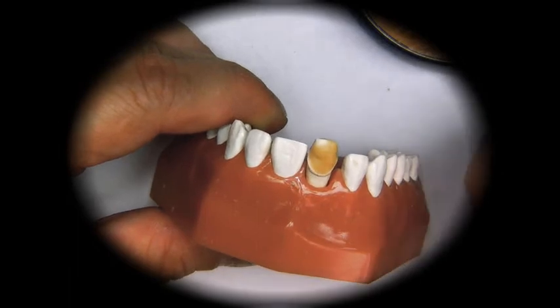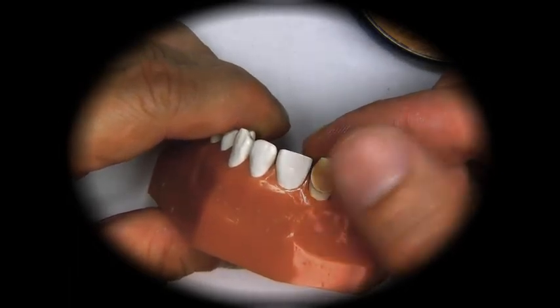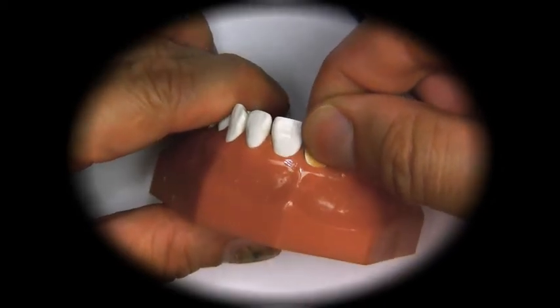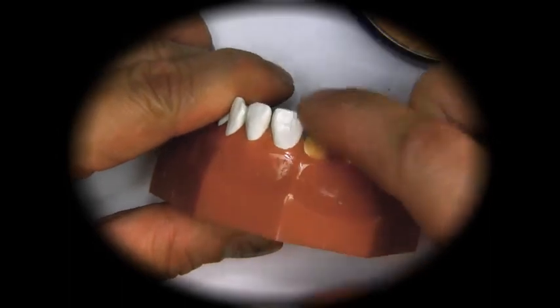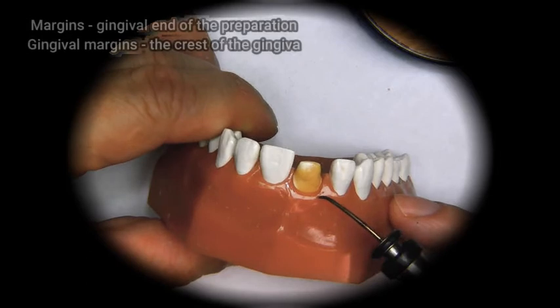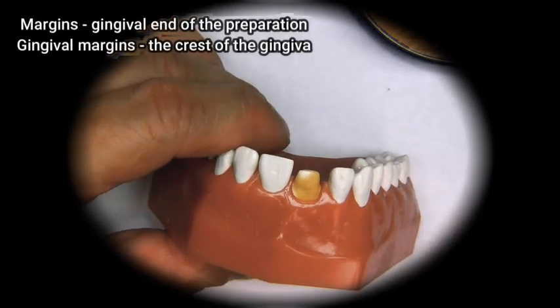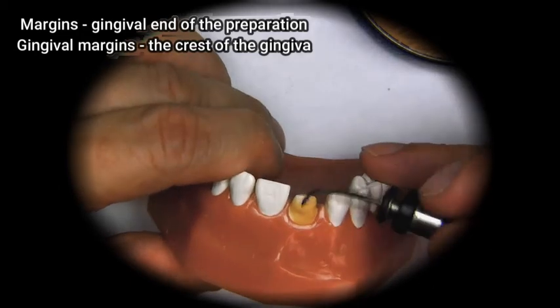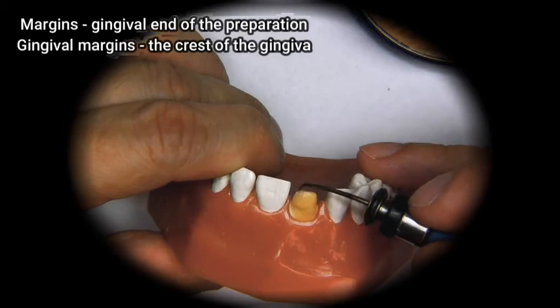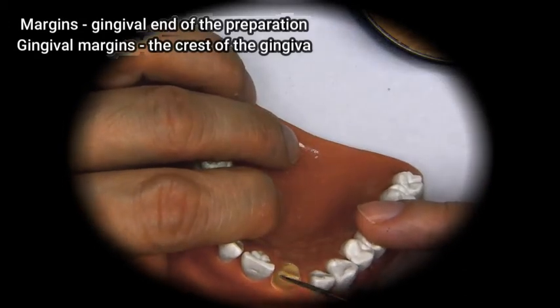So we hold the die from the lingual, or the tongue side, and the labial, and then push it all the way down until the margins are below the gingival replication. Then we can further add some wax where it's thin and complete our coping.